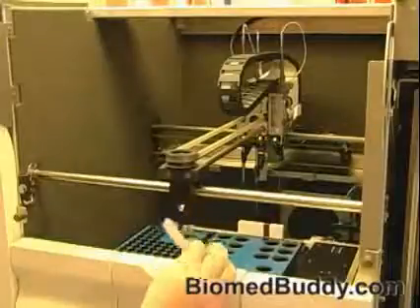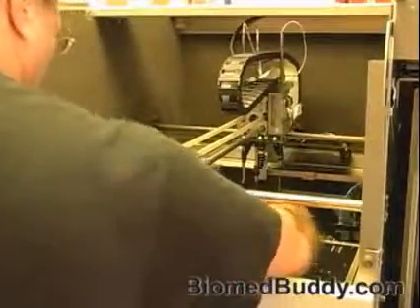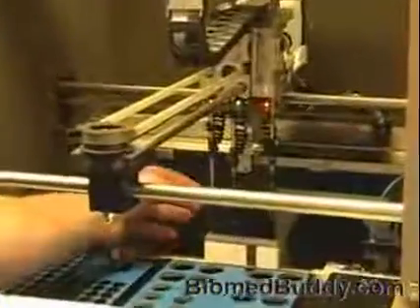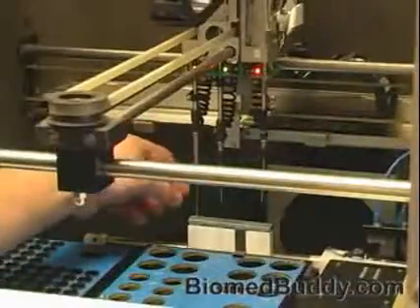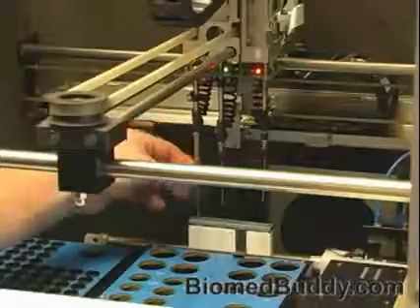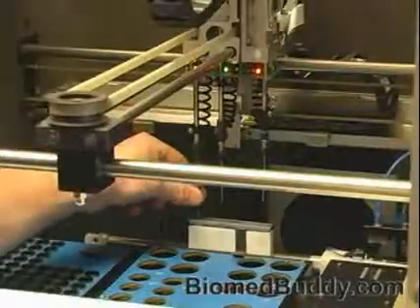We've got a little tool here, it's a mapping tool. I love this thing, it's one of the nicer things Stago came up with. And what it allows me to do is put the needles in the dead center of my wash wells. Now you watch me. If these were new needles, in theory that should go right in. But since they're not new needles, I'm going to make some adjustments because these somehow, for some reason, have gotten bent. And I'm making the adjustments so that that needle goes straight down into wash well number 1.